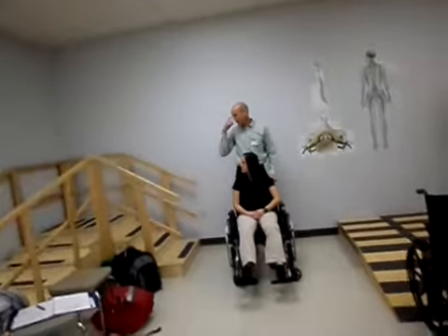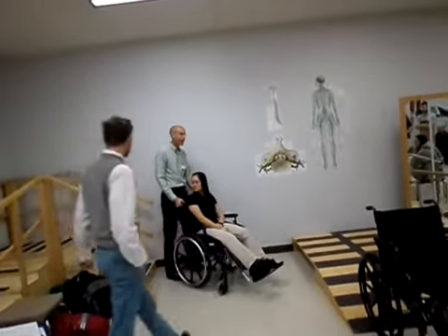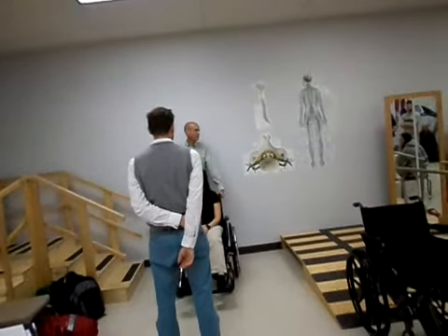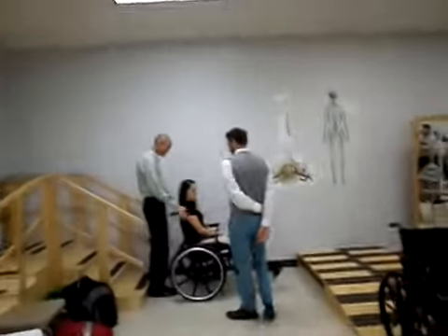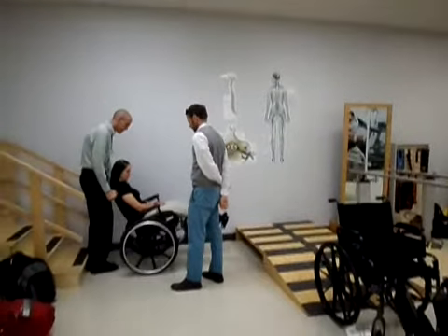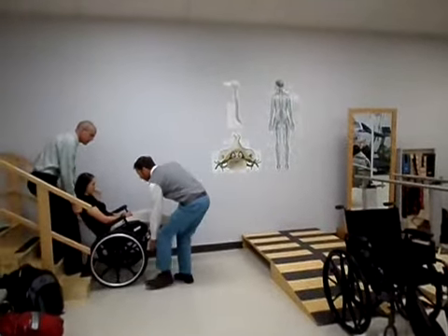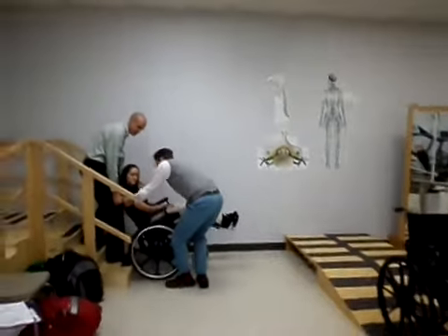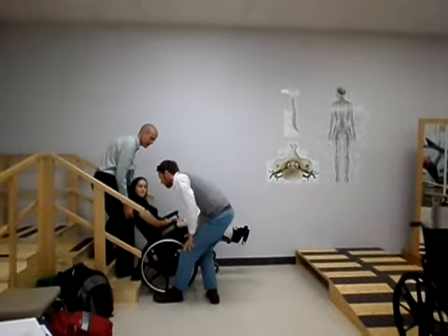And we don't have as much room here, but let's see if Jay can help me a little bit with this. Are we going to go frontward or backwards? Backwards. You got to go back. You cannot go frontwards up a step. So that's why we just practiced it over there. All right. I took you backwards. All right. Jay, can you get on one side? Are you able to do like we did before? Is there enough room there? Not up the stairs, probably. Okay. Did you grab both bars at the bottom?